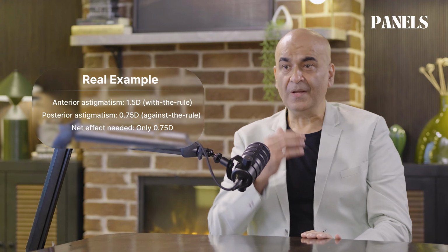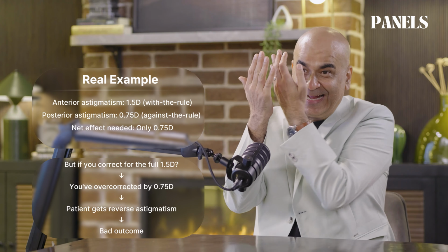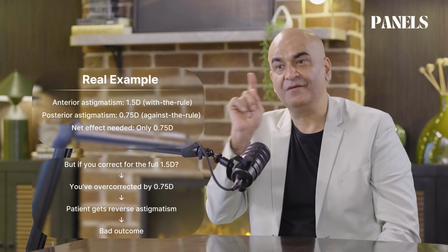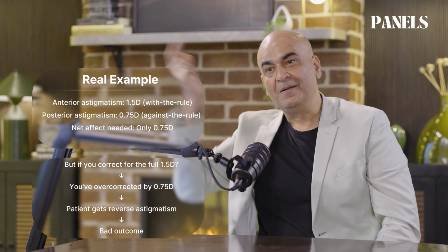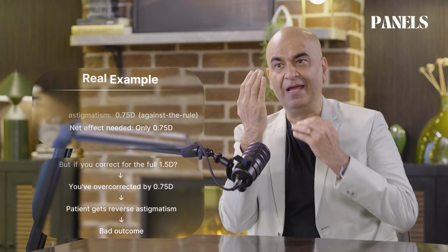So which means if my patient has 1.5 diopters of astigmatism, which is with the rule, and there is 0.75 against the rule behind, my net effect only required is 0.75 because the posterior curvature has already corrected. But if I just measure the anterior, and I put a lens according to this, I will overcorrect the patient.